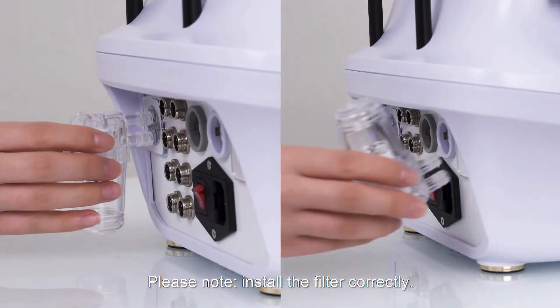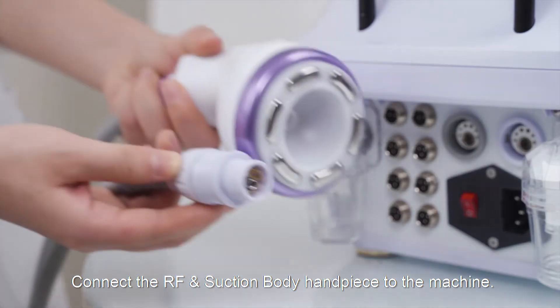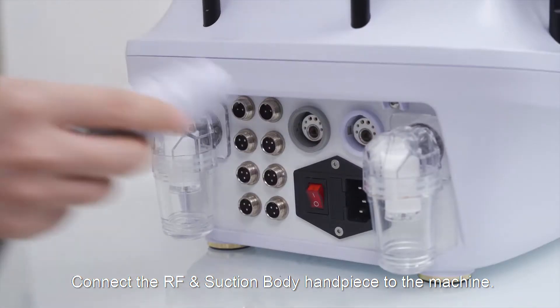Please note, install the felt correctly. If it is not inserted fully into the hole, air may escape and there will be no vacuum. Connect the RF and suction body handpiece to the machine.